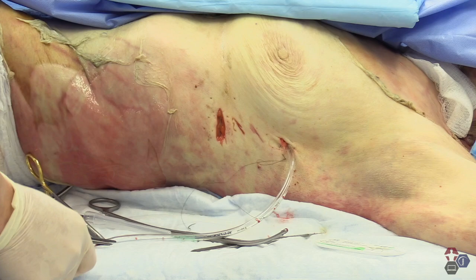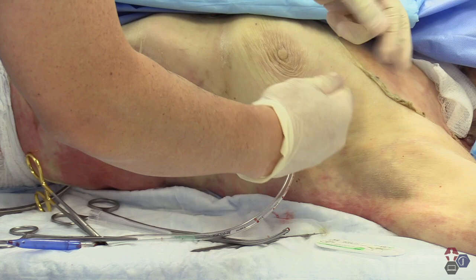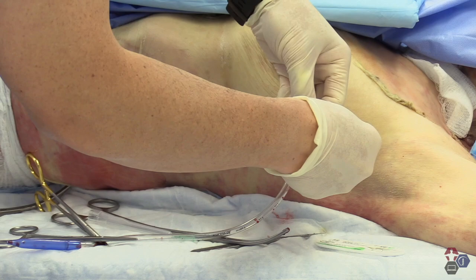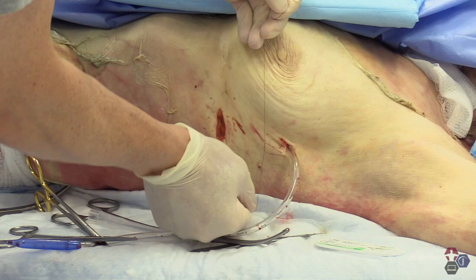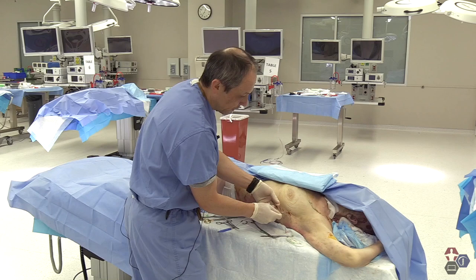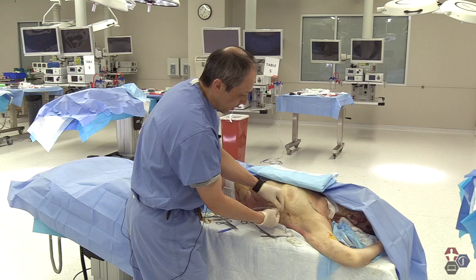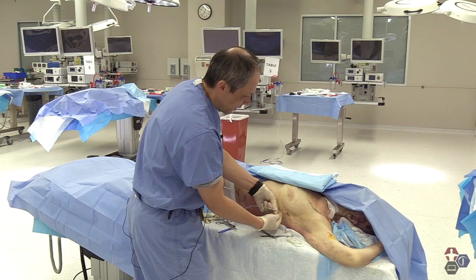Now it is important at this point that you do not lock the suture down. From here, you want to cut off the needle so you don't end up accidentally sticking yourself. Then do one loop in a circle, another loop in a circle, and gently pull close together surrounding the hole. The reason why you do not want to reverse and lock the suture down is because later on when the chest tube is removed, they could simply pull the sutures together and close the wound. By closing it rapidly, it'll decrease air from entering the wound, preventing a pneumothorax afterwards.